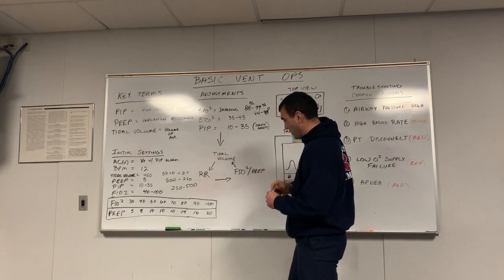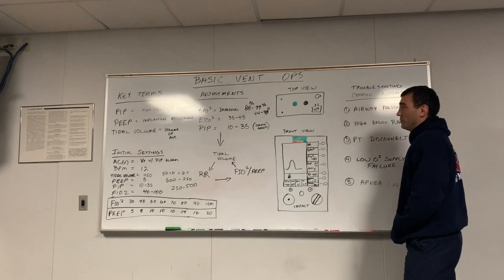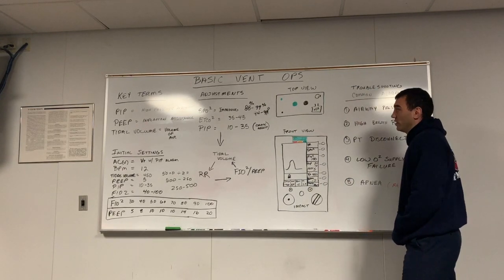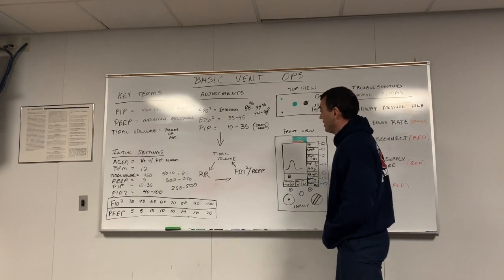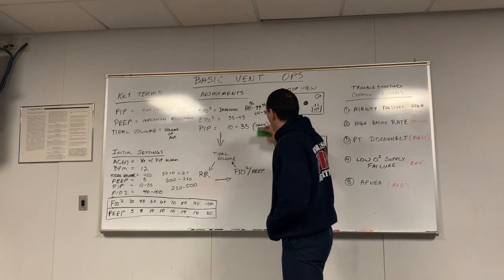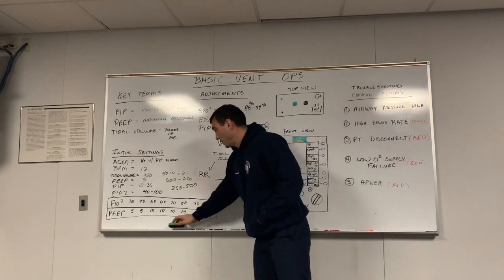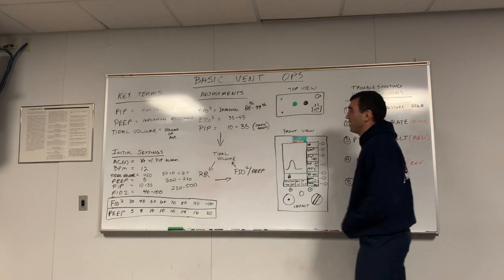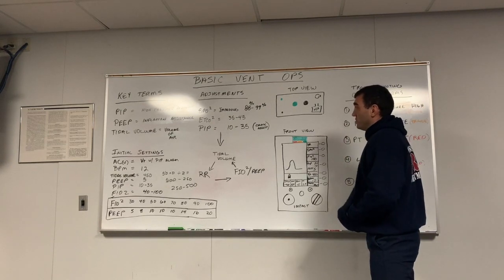We should all know why we don't run it to 100, or if it runs to 100, we need to start making adjustments, because we don't know what that number really is. Could be 101, could be 140, we don't know what it is, okay? So 88 to 99 on a COPD patient, 94 to 99 on everybody else. Okay, so obviously you just have to assess your patient, what was their condition before, what's causing this problem, and that will let you know if they're doing okay.